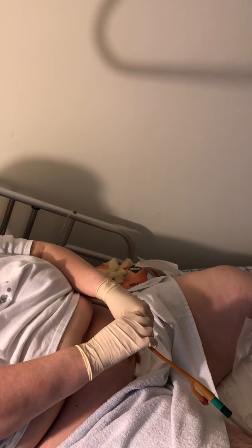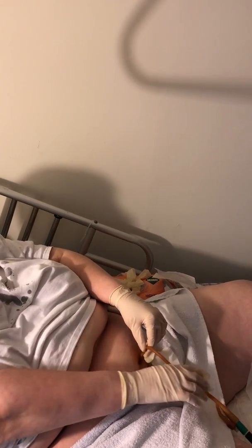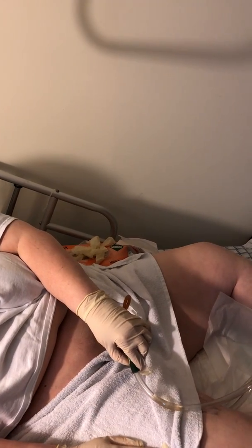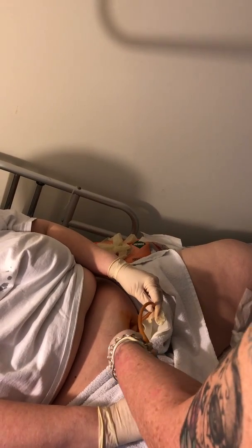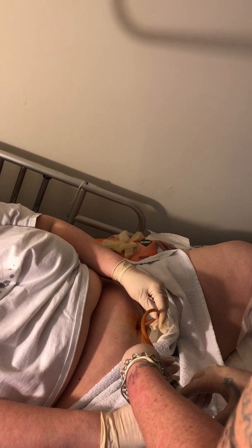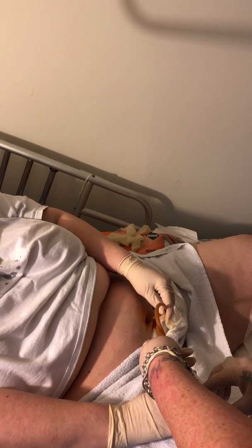I can feel when the old catheter comes out right at the bladder wall, and I can feel when the new one goes in, when it goes through the opening in the bladder wall. And I can tell it's in, and this is what I mean by instant return. You can see there in the tubing, hopefully. We can. Ready? Yeah, we're ready to inflate the balloon now. I'm putting 8 in. Now, I use 8 cc's in the balloon. That's what works for me. Now we inflate slowly, just in case it's not all the way in.